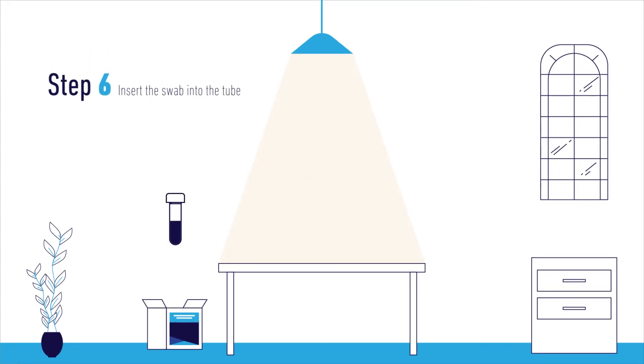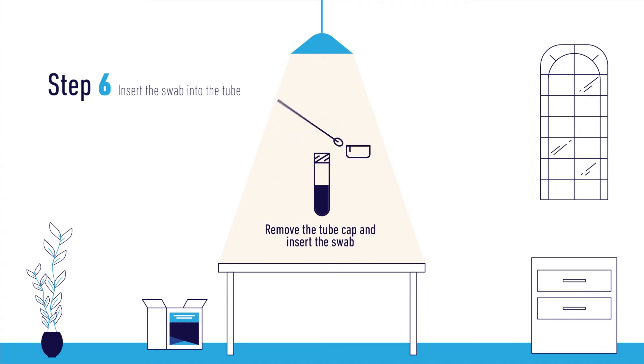Step 6. Without setting the swab down and touching any surface, remove the cap from the provided tube. Insert the swab into the tube, then swirl the swab vigorously into the solution and break it at the perforated edge.